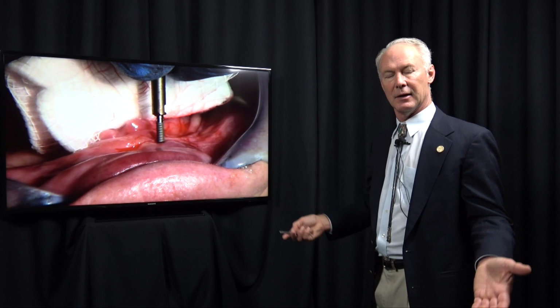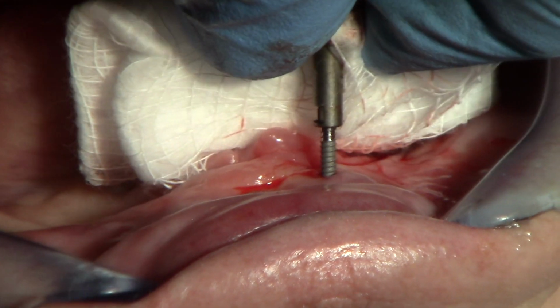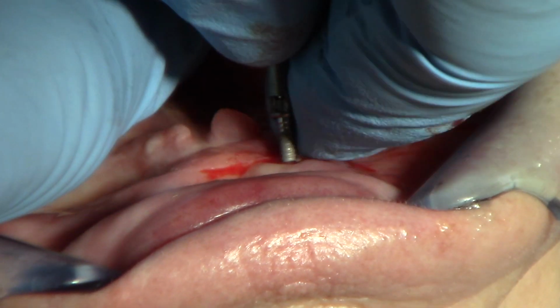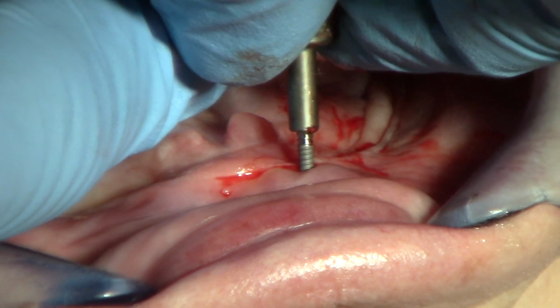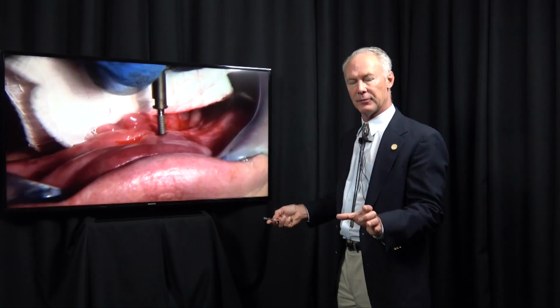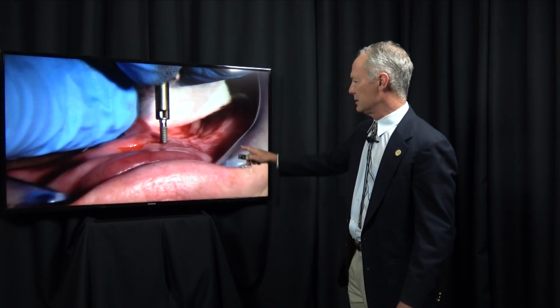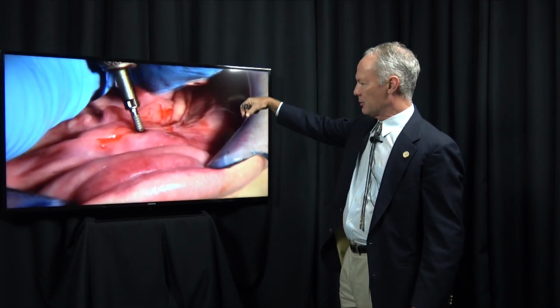You want the implants to be as long as possible. The longest is 18 millimeters. So they go anywhere from 10 to 18 millimeters in length, and from 1.8 or 2.0 to 2.5 or 2.9 millimeters wide. So the wider ones are for the maxilla, the thinner ones are for the mandible. Just because this bone is so much denser, it's harder to screw the implant in.